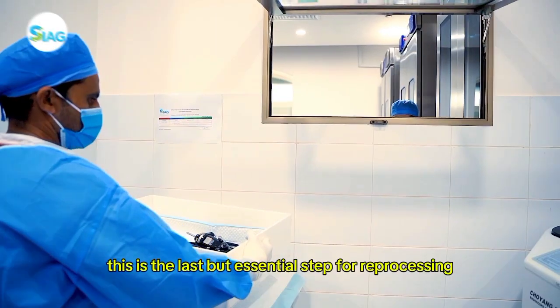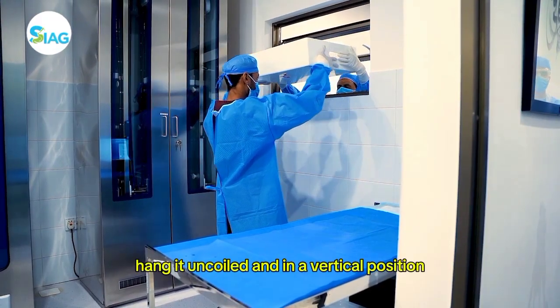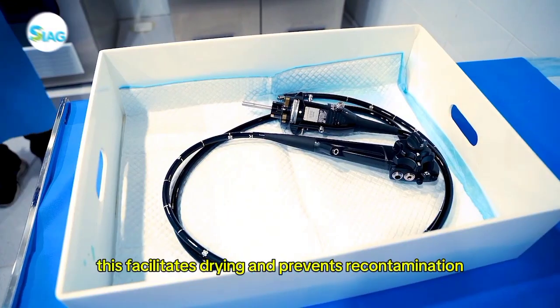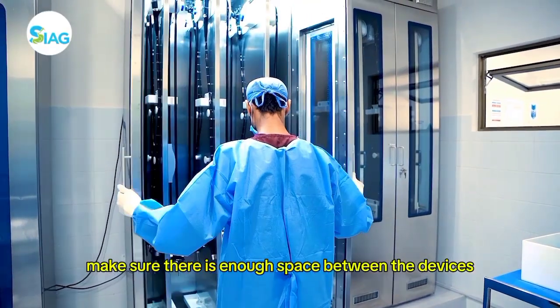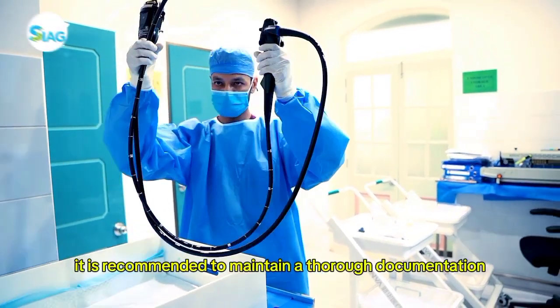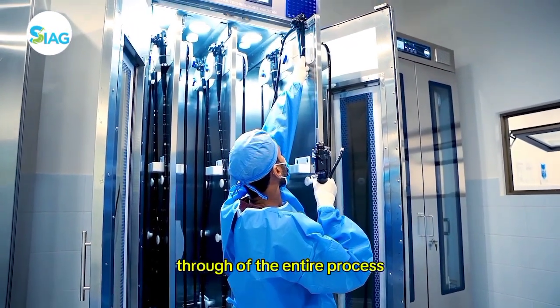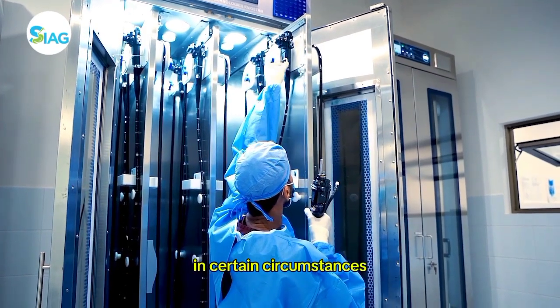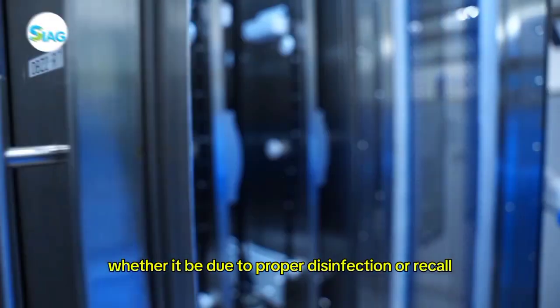This is the last but essential step for reprocessing. When storing your scope, hang it uncoiled and in a vertical position. This facilitates drying and prevents recontamination. Make sure there is enough space between the devices to avoid damage by contact. For quality assurance purposes, it is recommended to maintain thorough documentation of the entire process. Having the record can be very helpful in certain circumstances, whether it be due to proper disinfection or recall.